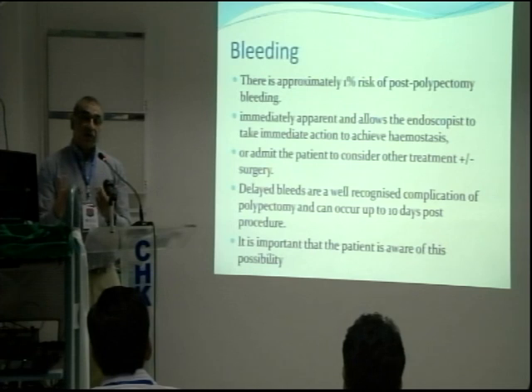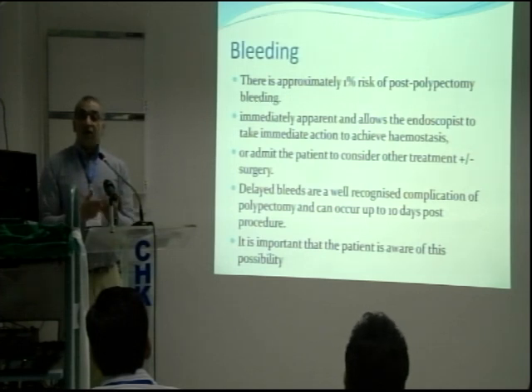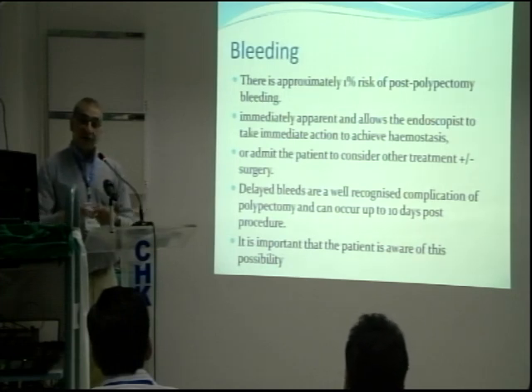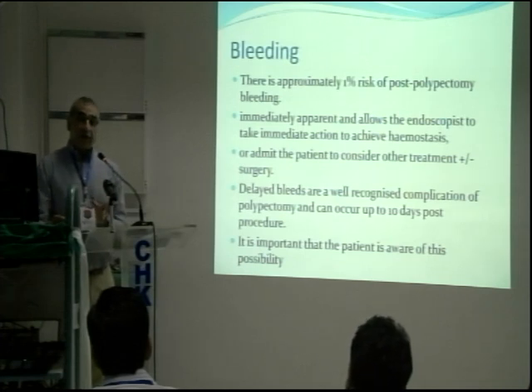Just put it on tight, don't have to do anything. Hold it tight for a few minutes and it will stop the bleeding. You can then put a clip on it, you can diathermy it or whatever, but the important thing is don't move from there.